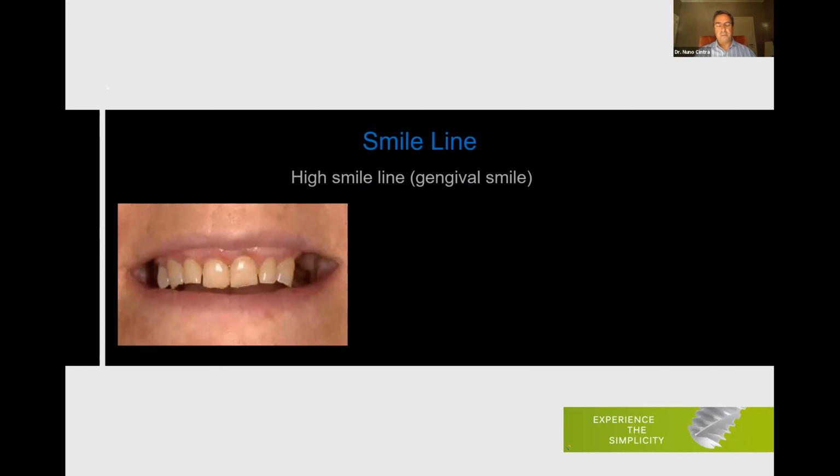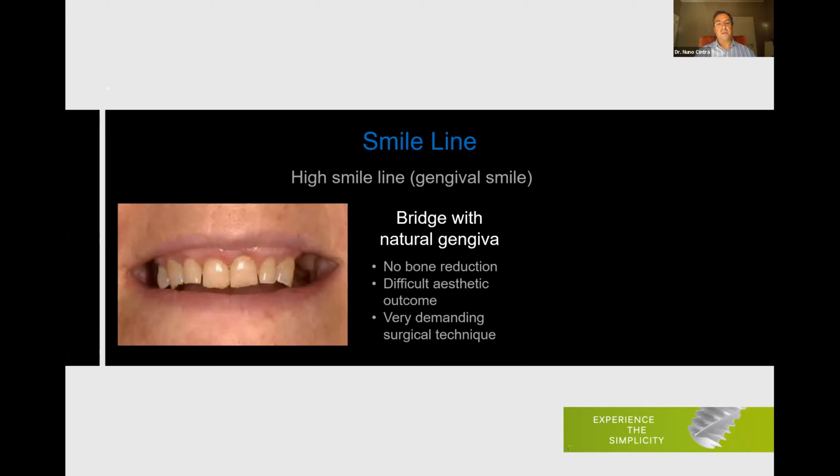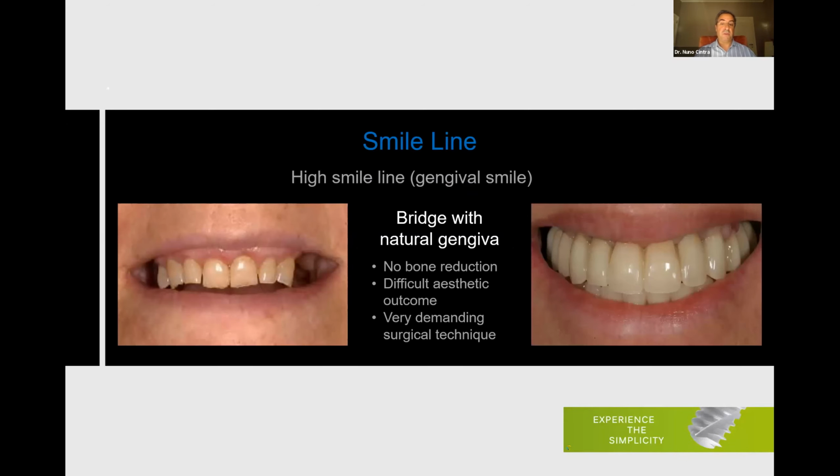When the patient smiles, we can see a lot of gum. So we can solve that by doing a bridge with natural gingiva. In this situation, we don't need to do any bone reduction, so we don't touch the bone. But as you know, it is very difficult to maintain this aesthetic outcome over time.